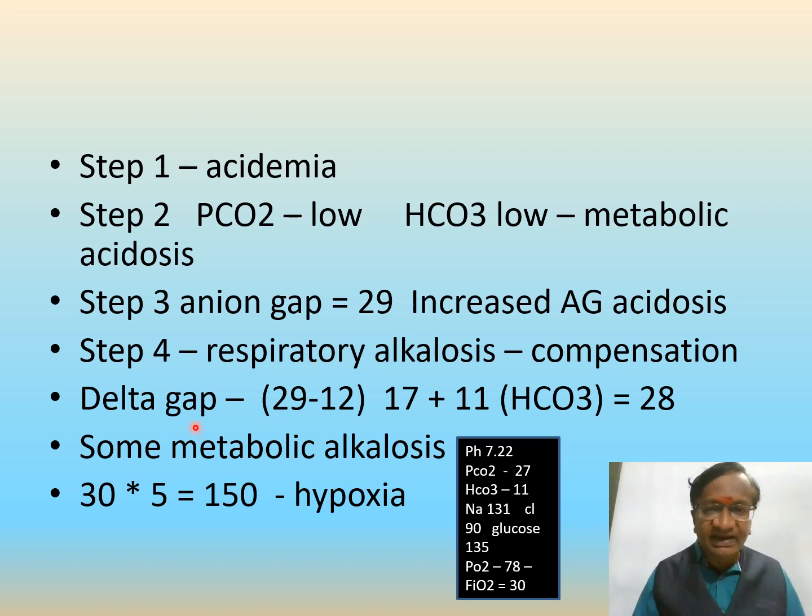Now is step 4, compensation. What is the delta gap? I have already told, plus 11 is equal to 28.